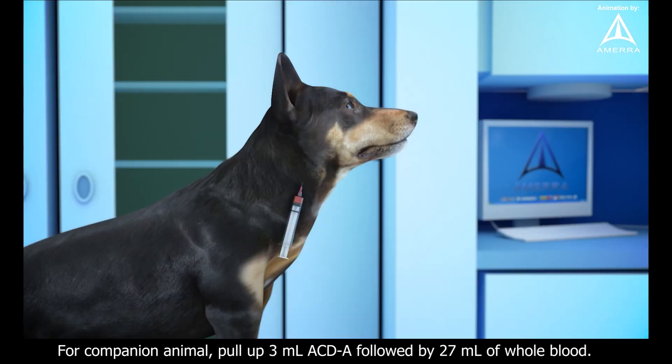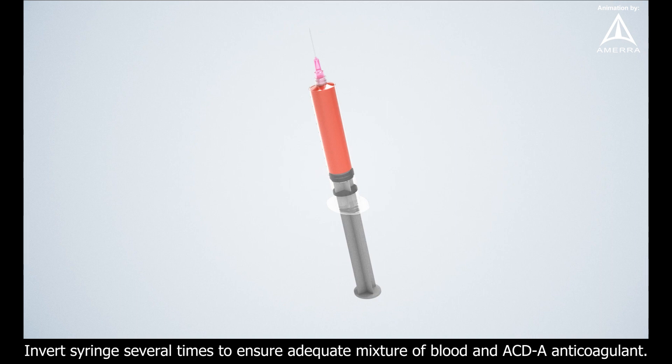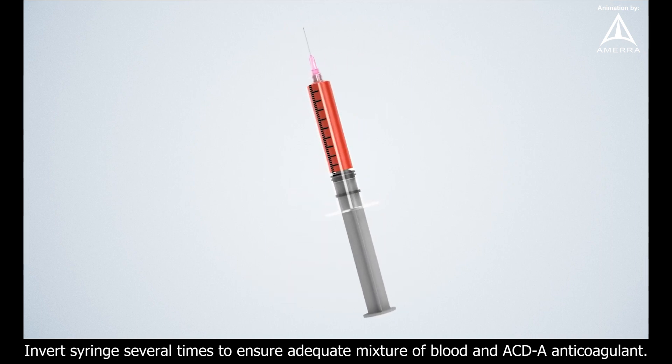For companion animal, pull up 3 ml ACDA followed by 27 ml of whole blood. For equine, pull up 6 ml of ACDA followed by 54 ml of whole blood. Invert syringe several times to ensure adequate mixture of blood and ACDA anticoagulant.